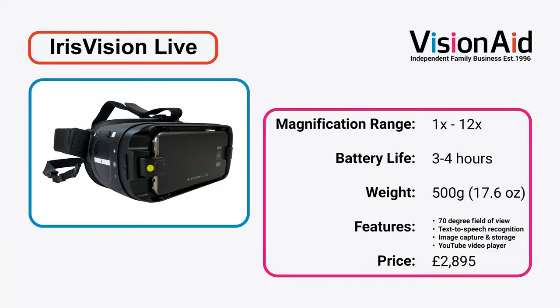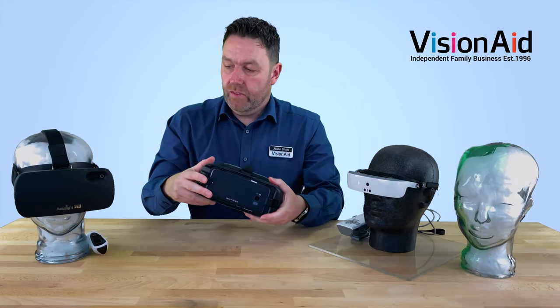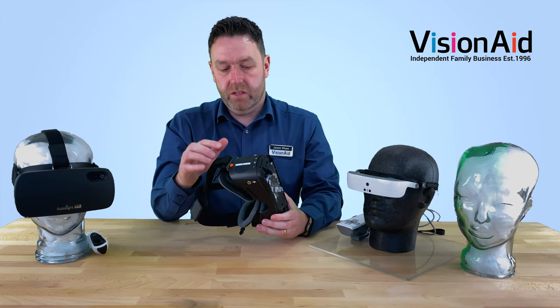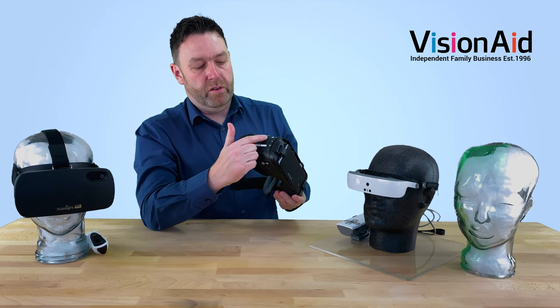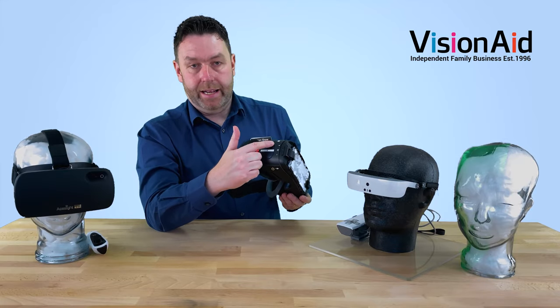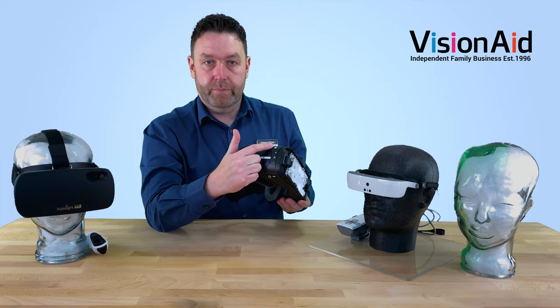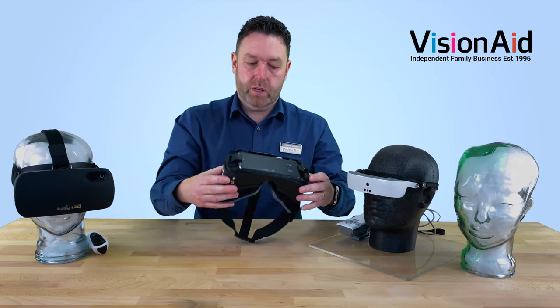Now let's take a look at the Iris Vision. This is another one that uses a virtual reality headset, again with the mobile phone clicked in here. The main difference between this and the A-Sight VR is that this doesn't have a separate controller — all the controls are built into the headset. You've got a pad that you stroke forwards and backwards to zoom in and out, and then buttons to change the modes, one to take pictures, brightness, and various other controls.